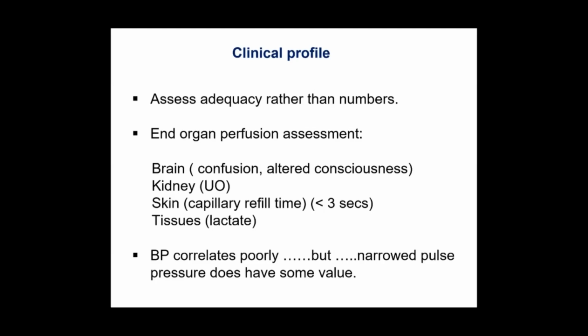So these are windows. Yes, they will give you obvious signs when a patient lands up with you in the emergency setting or in the ICU setting, ideally in the emergency room first. But if you have a patient already admitted and you find him deteriorating, it is always preferable to use advanced hemodynamic monitoring before these deteriorations in the vital organs start giving you the picture.